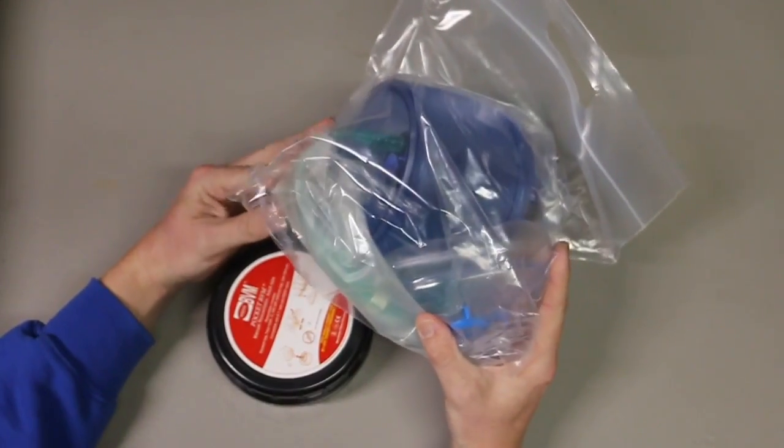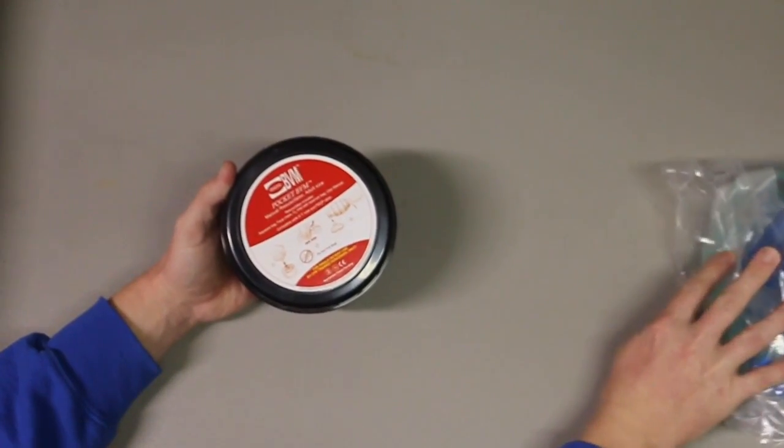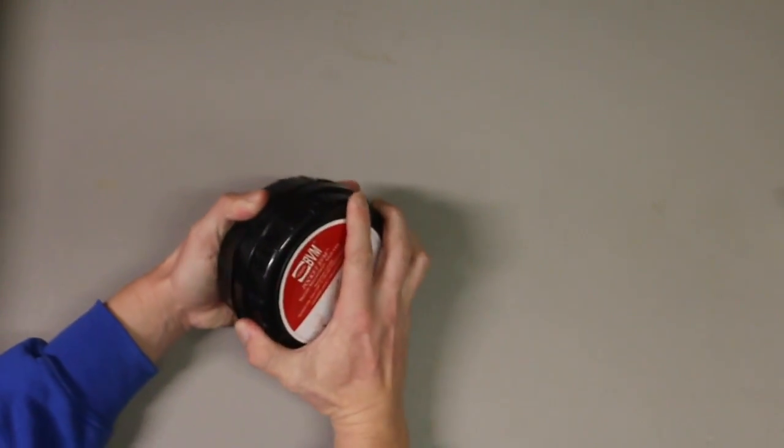So this can be hooked up to oxygen — so can this — but this is really small and compact. I just want to kind of show you guys this product real quick.